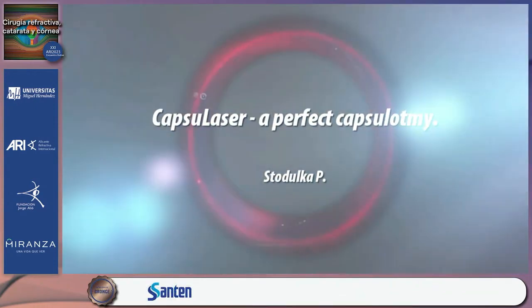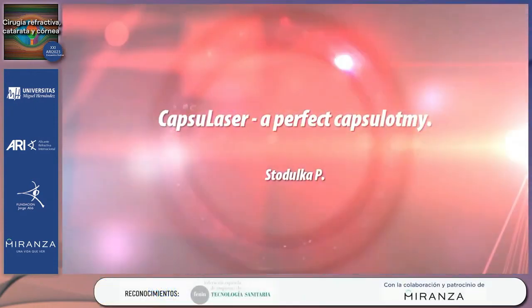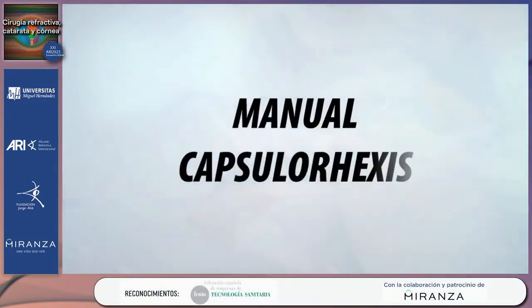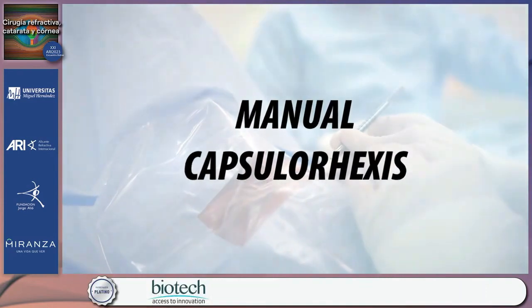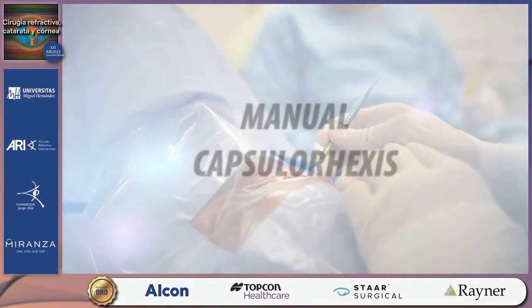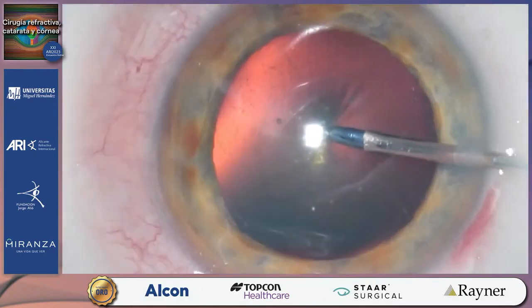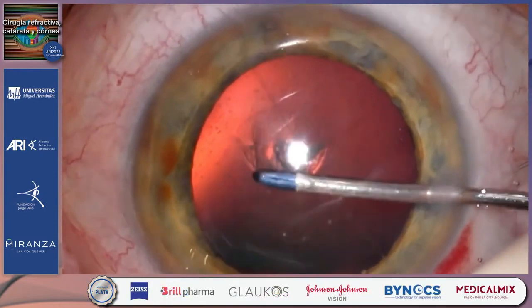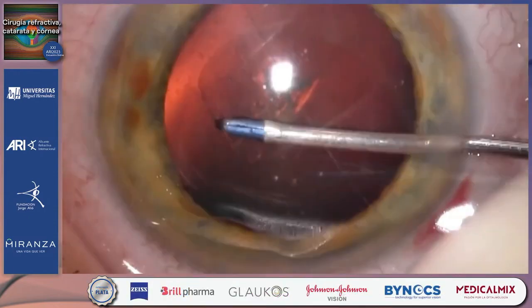A circular opening in the lens capsule is a gate inside the lens for cataract surgery. The most common way to open the capsule is a manual capsulorhexis. Handheld forceps are introduced through the main or side port incision to punch the capsule and create a circular opening in it.